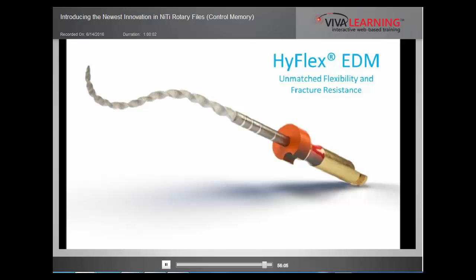With a small access like the one you depicted earlier, don't you risk leaving some tissue behind and creating unsupported enamel? Excellent question, excellent point. The answer is no. I am able to remove all the tissue from my case. I can use ultrasonics. I can use a round, small burr and go under the pulp horns. And remember, my chamber is flooded at all times. And when you de-roof the pulp chamber, everything is removed. We just don't want to over-enlarge the access cavity. And as far as unsupported enamel, the less dentin and the less enamel we remove, the higher the strength of the tooth. We need to stop removing unnecessary tooth structure and prevent these teeth from failing on us.